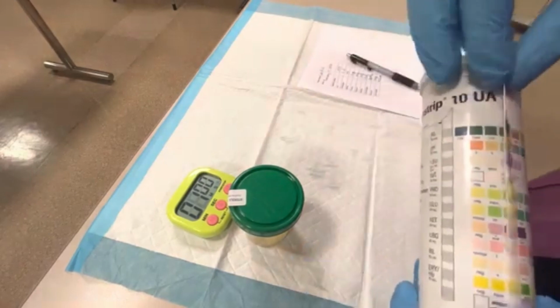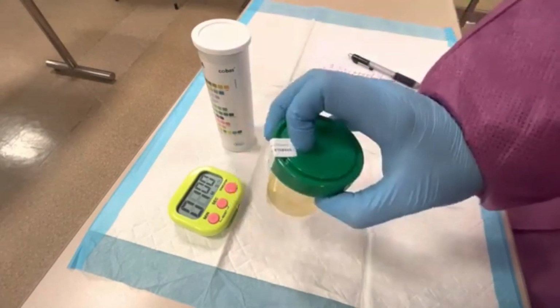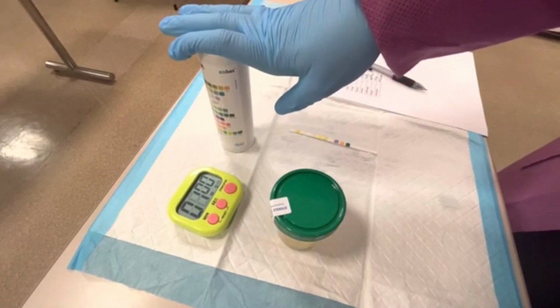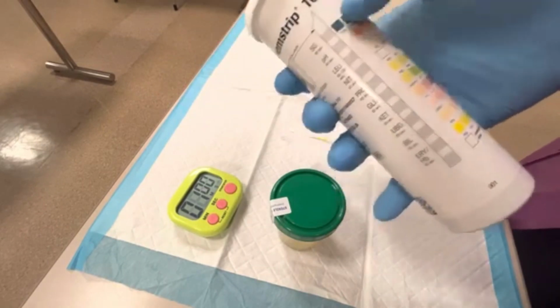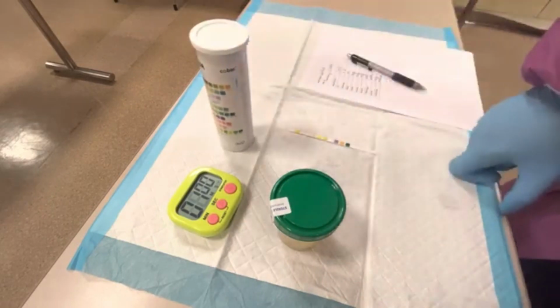Okay. Now what I'm going to do is take this and discard it in the trash and then put this away for proper storage. Now, if you have not watched my urinalysis videos yet, go ahead and do that as well. I will go into great detail about what all of these results mean. But this was just kind of a demo of how to do the urine dipstick test.